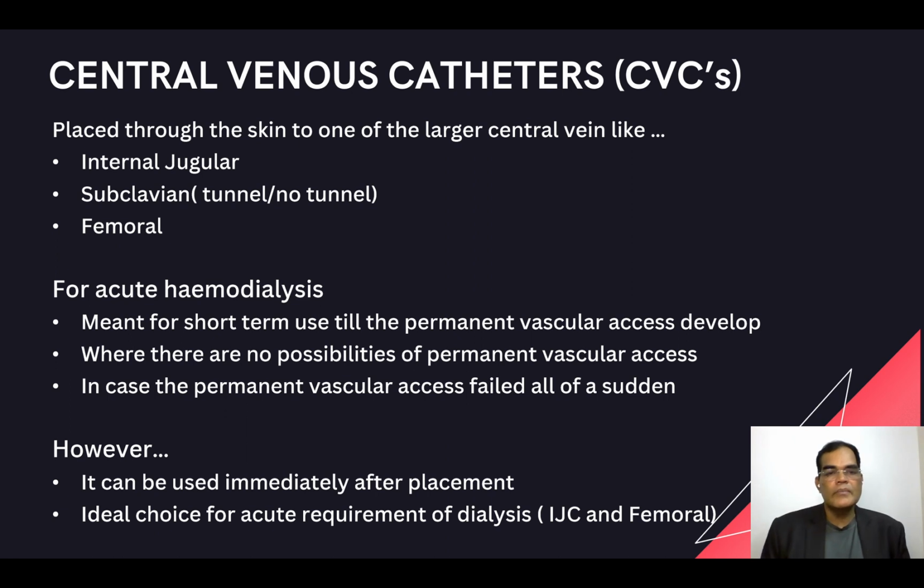If you look at central venous catheters, it is basically placed through the skin into one of the larger central veins, like internal jugular, subclavian, with tunnel or without tunnel. There are various methods, and femoral catheter. I'm taking only the prominent forms of central venous catheters. Sometimes it is placed in various places as well, but as a common procedure it is placed in a central vein.